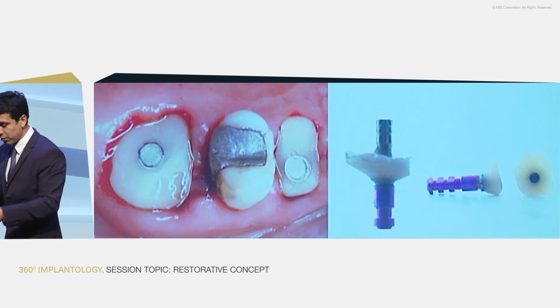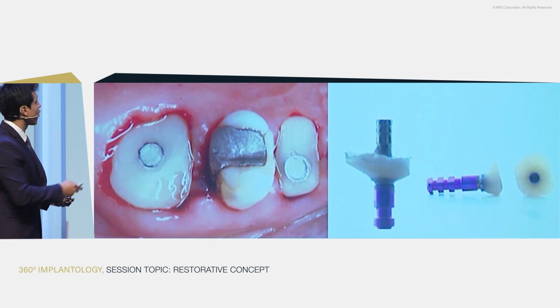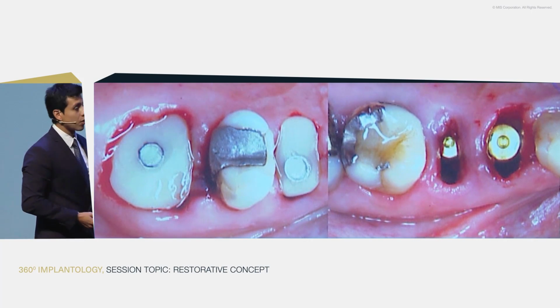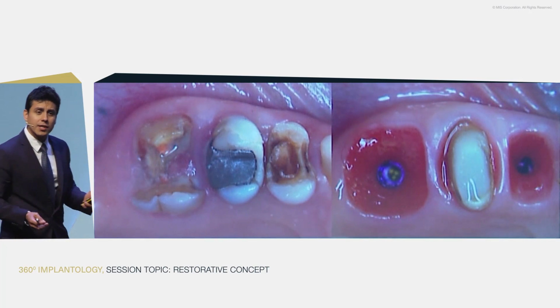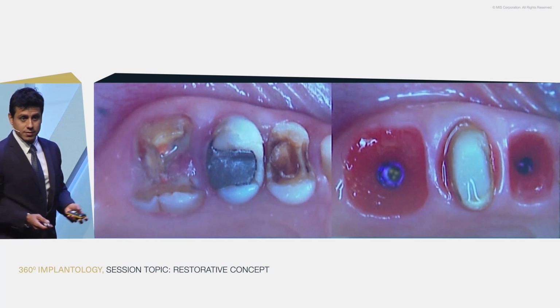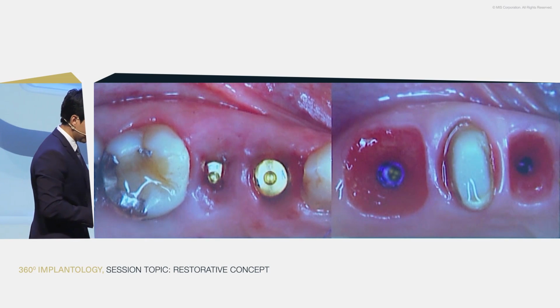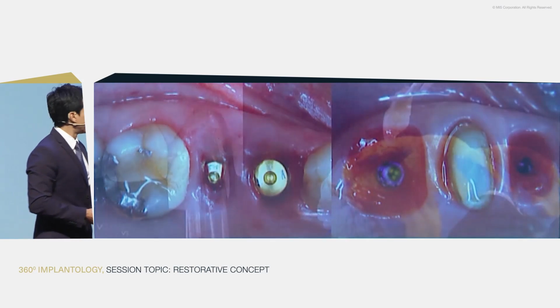After this, we will work with burrs and rubbers, and we will perform these custom abutments. Okay? This is the approach. It's a simple approach. Instead of the normal and usual approach, we start to use the customizing approach, and you can achieve a good, acceptable outcome 4 months after the implant placement. So you have 2 choices nowadays to work with the MIS components. You can follow this way or the customizing way.